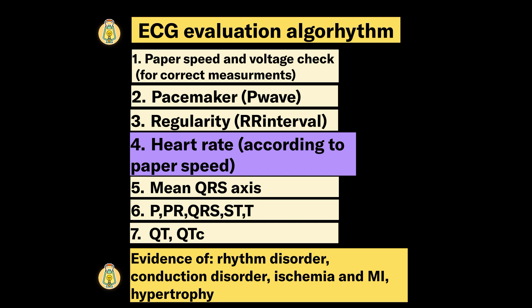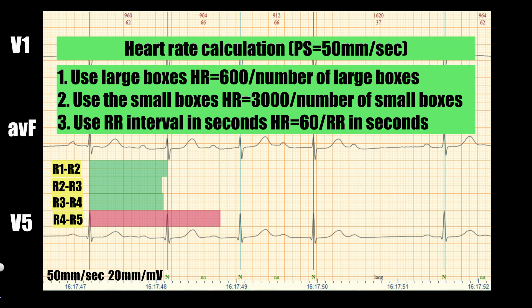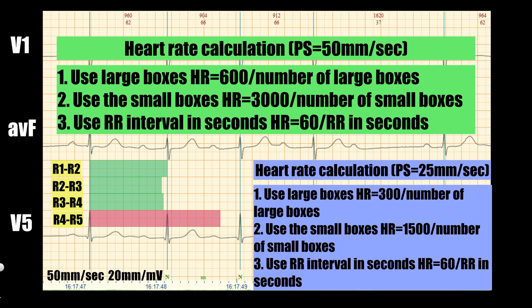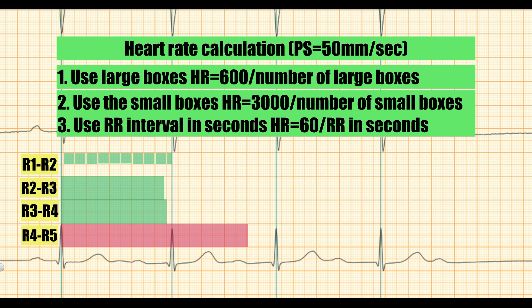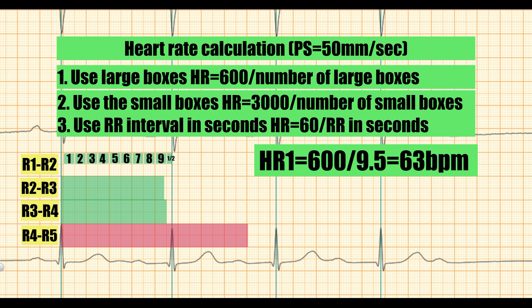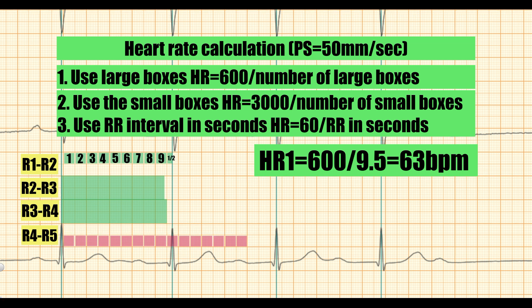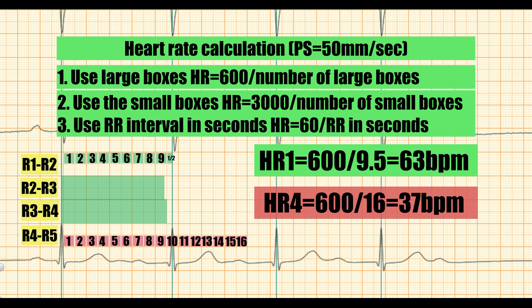The next step is heart rate calculation according to paper speed. Using large boxes: calculate how many large boxes the RR interval consists of. In our case it is 9.5 large boxes, so 600 divided by 9.5 gives a heart rate of 63 beats per minute in the first RR interval. For the bigger RR interval we have 16 large boxes, giving a heart rate of 37 beats per minute.